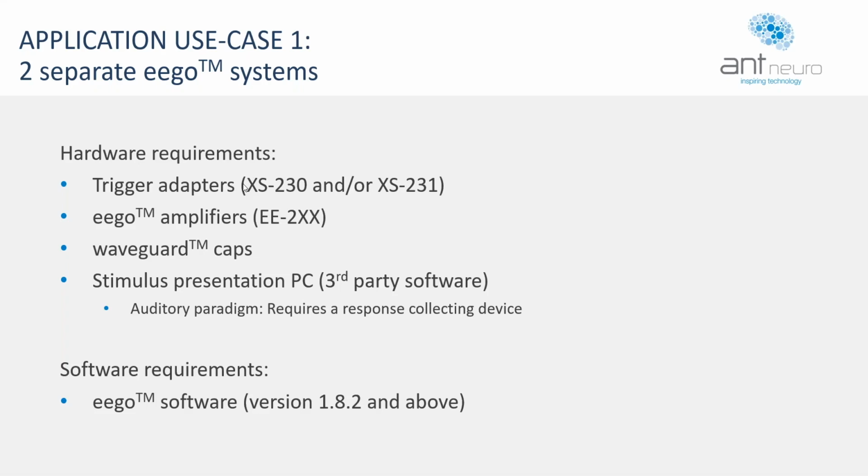You would need a waveguard cap from us to do this, and this would work for any sensor modality. So whether or not you're using our gel caps, our dry caps, or net caps. You would of course need a stimulus presentation PC, and this would have to have presentation software, so either E-Prime or PsychoPy, you could use anything that's out there.